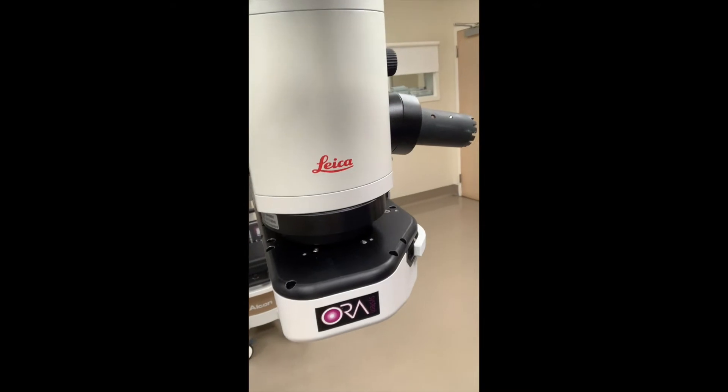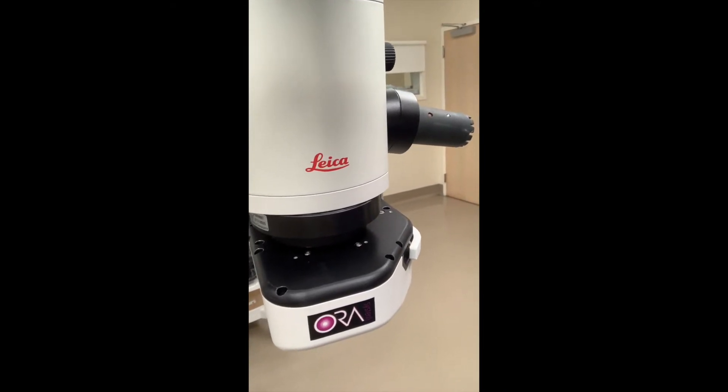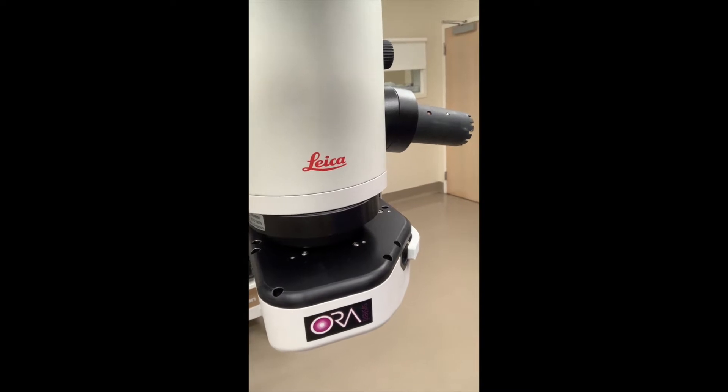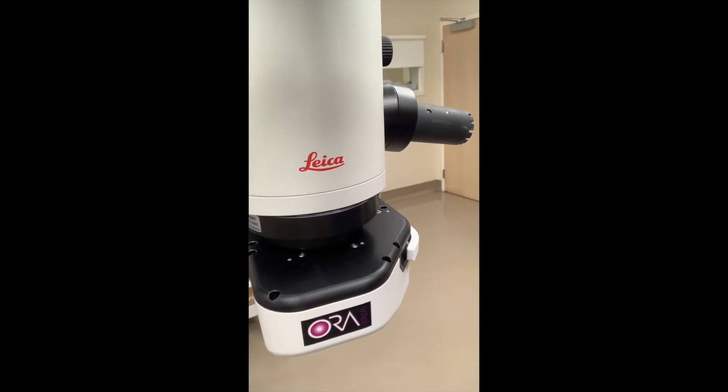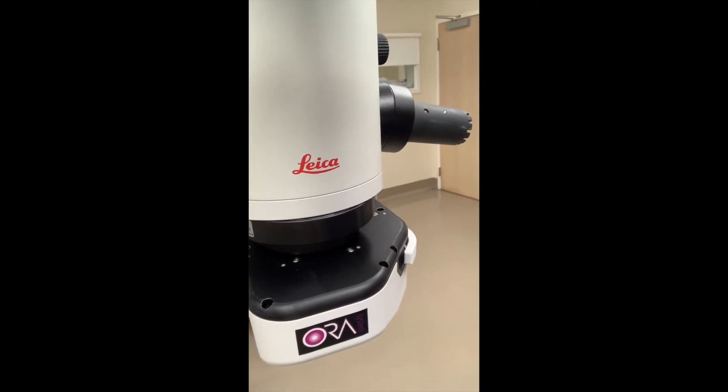So this is the Aura, which is what we use to measure the intraocular lens. After the cataract is removed, we double check the pressure and double check the vision with this Aura unit, and it tells us exactly what power we use for the implant during surgery.